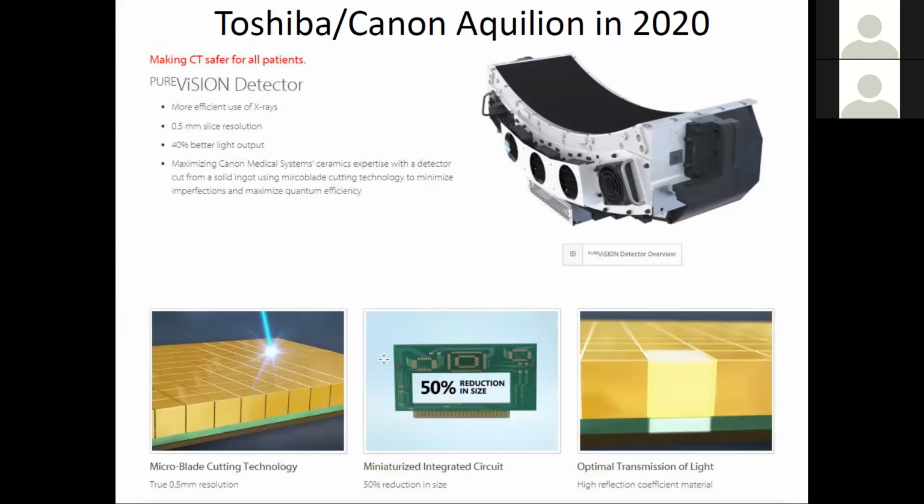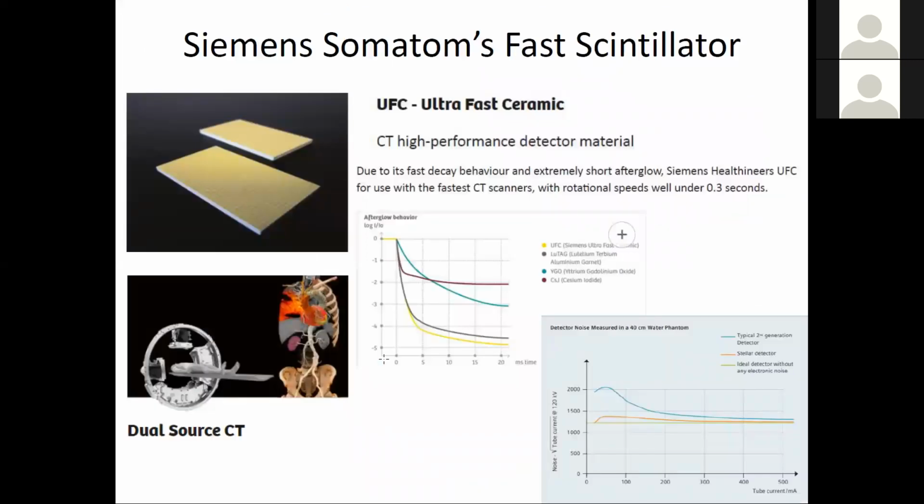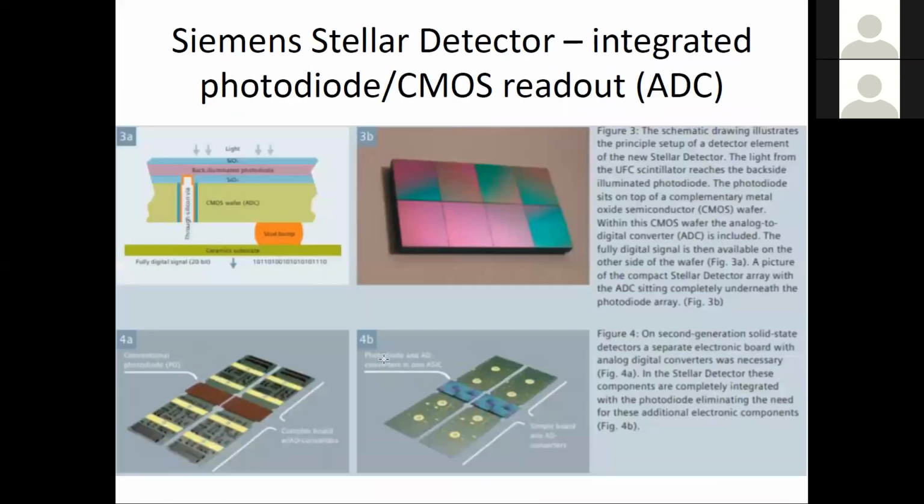So the detector arrays look like this. You get higher spatial resolution if your crystals are smaller, okay? And you want to have a good optical design to collect a lot of signal. And again, you want to have good time structure for the signal. You want to have good collimation at the detector, and a nice monolithic block where you can build the whole thing and make it cheap. The other things you can make advances on are the scintillator, again the speed of the scintillator and the cost of the scintillator. So people develop on that. You can continue to develop the sensors a little bit where you're integrating, which is nice. Your ADC, your readout with the photosensors, that's one particular vendor.